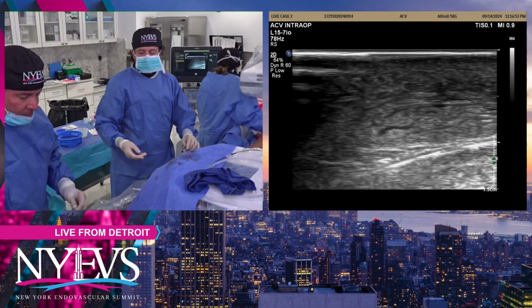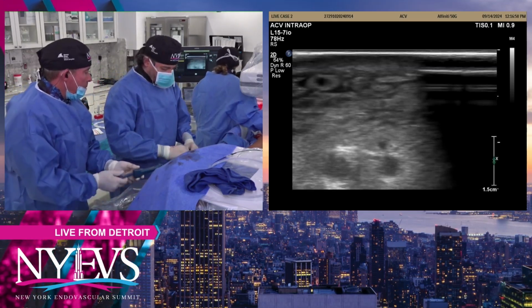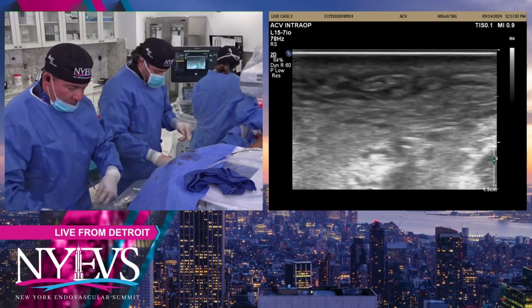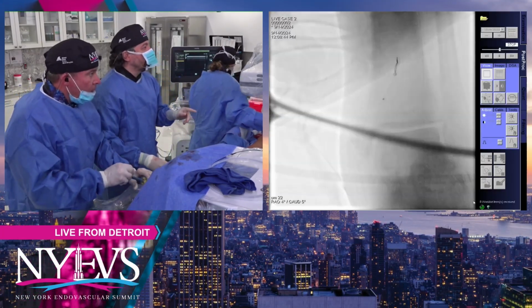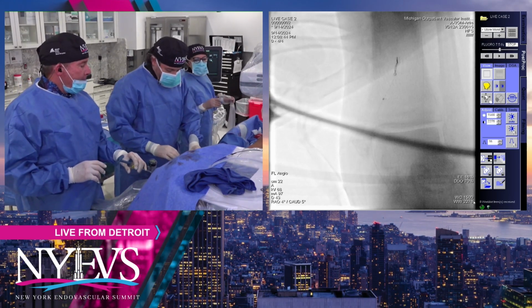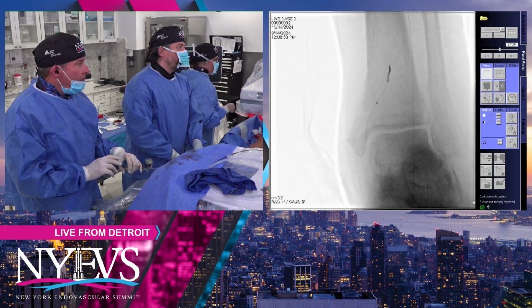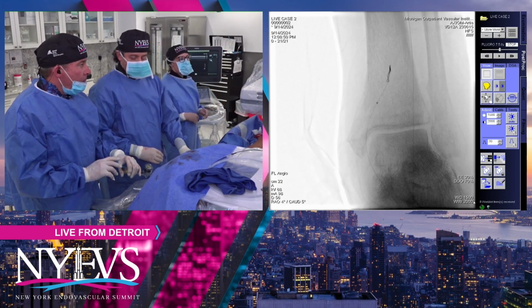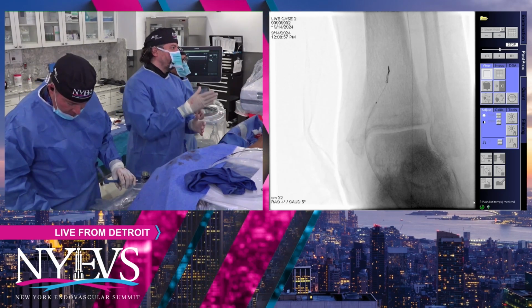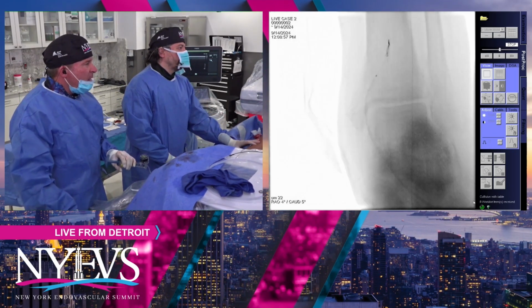Let's go. Just a quick question. Do you ever give an injection through your retrograde catheter to see, or you don't in case you're too subadventitial? So I am actually, sorry, Keelan. Where I am right now, the tip of my balloon is in an occlusion. So if I inject, I know for a fact, let's go up to 4, I know for a fact I'm going to see, not extravasation, but you know when you see that look when you're in a CTO per se.